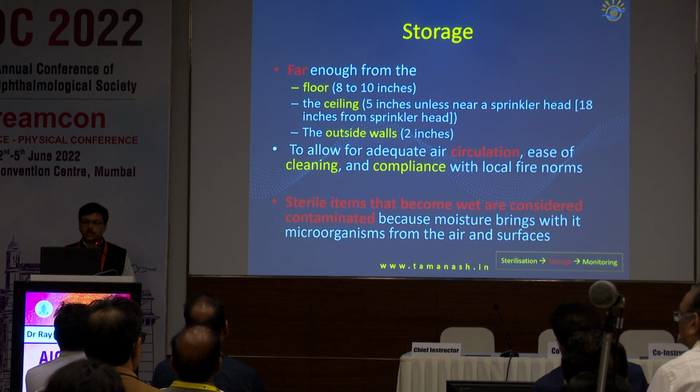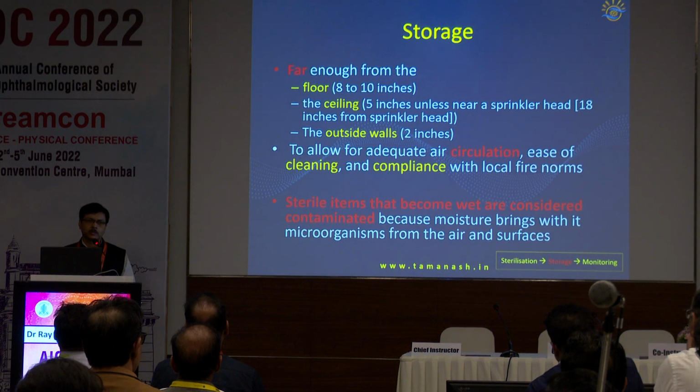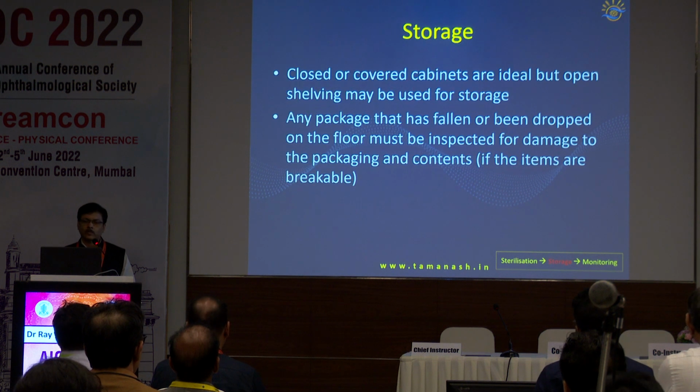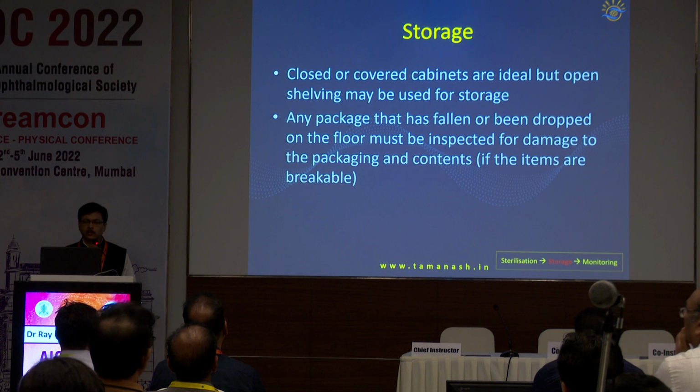So sterile items that become wet are considered to be contaminated. So even if you have the outer pack intact and you have used a plastic wrapper or a cloth wrapper, if it is wet, it is contaminated, it has to be re-sterilized. So ideally it should be kept in closed or covered surfaces, but open shelving is also permissible.